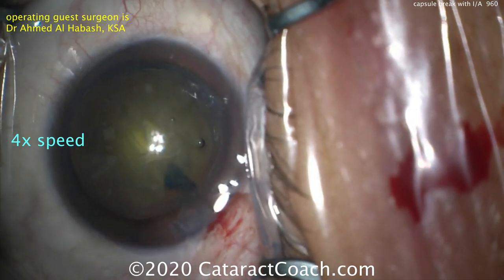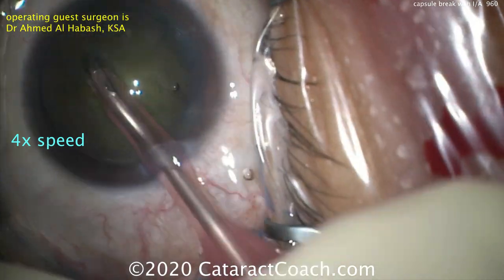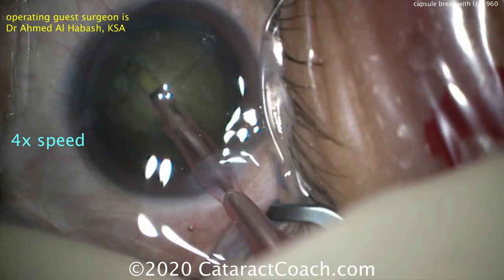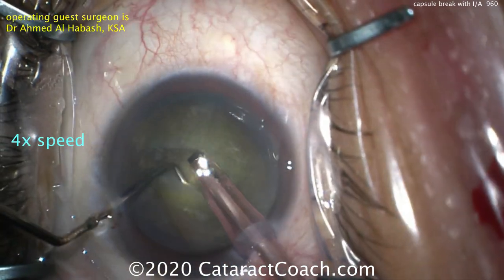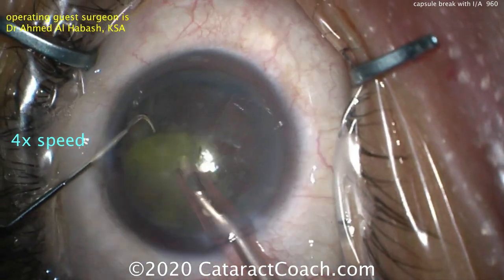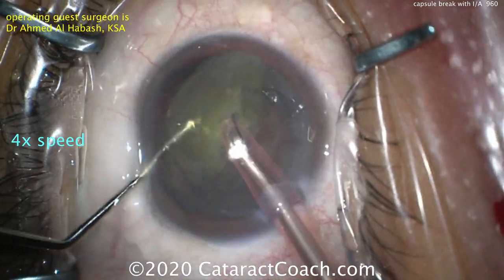We've sped up the video to get to the teaching portion on how to deal with this capsule break and have a successful outcome. In the phaco part, the nucleus is trenched down the middle, then split, the piece is brought up and chopped — a stop-and-chop technique. Very nice, good technique, and very efficient.